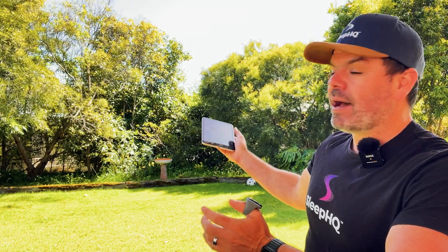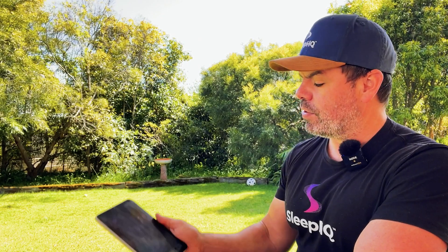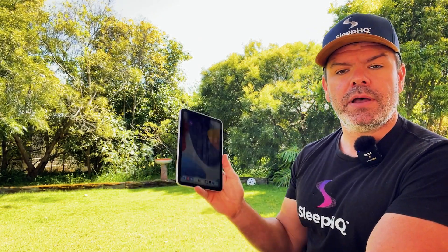G'day mates, beautiful Friday here in Melbourne. So I thought we'd head out to the backyard, sit in the sun, and I'll give you a demonstration of our brand new SleepHQ iOS app on an iPad.